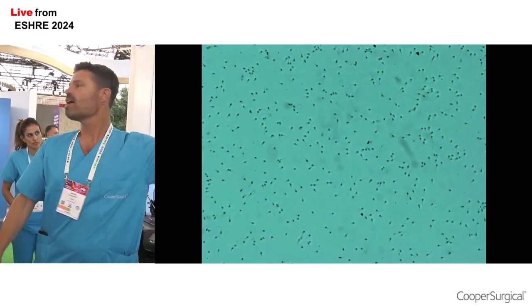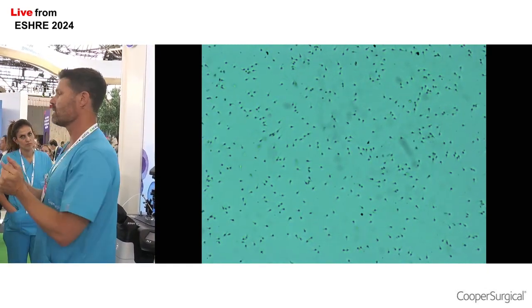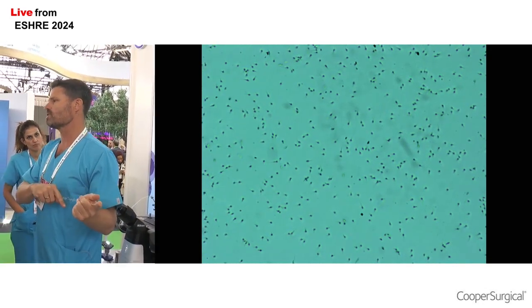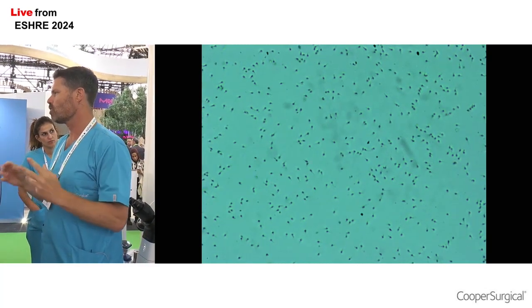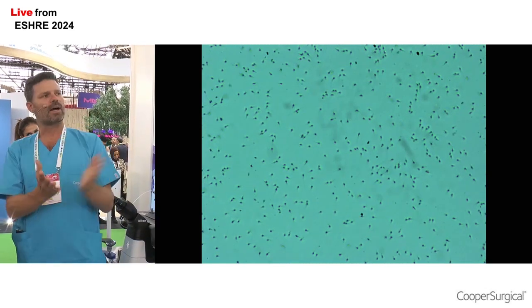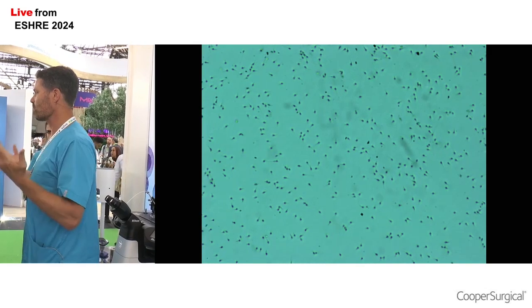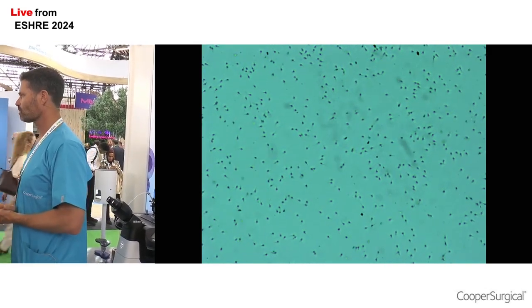Now this is a really high concentration. I would prefer, and that's what I said, in this case, I would go to the drop which has the lower concentration. It's going to help me because this would be difficult for me to select one sperm at a time, and it could be a bit complicated. So in that case, I go to the lower concentration drop. And you can see in this case, it's probably a good sperm sample. There's probably low amounts of DNA fragmentation. That's why we've got such good binding here. Then it doesn't matter if I load the same concentration of sperm sample.